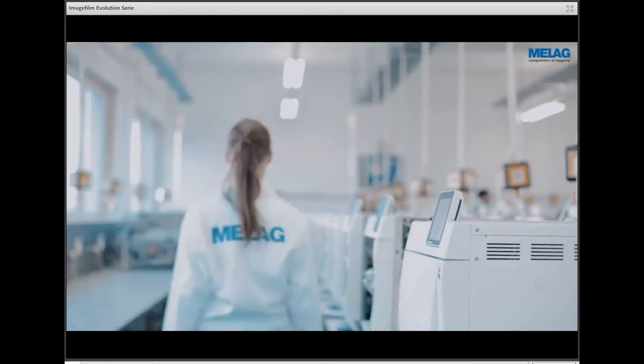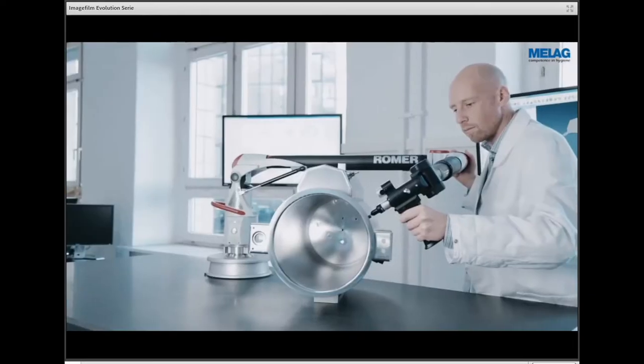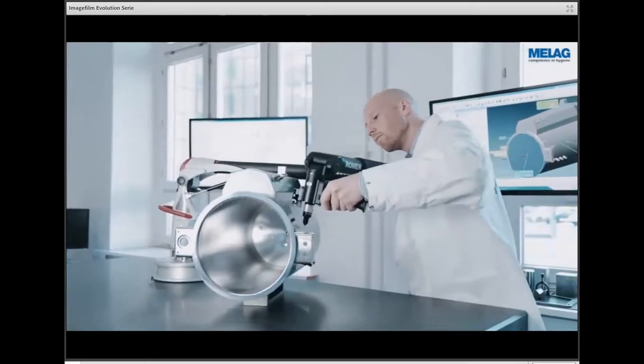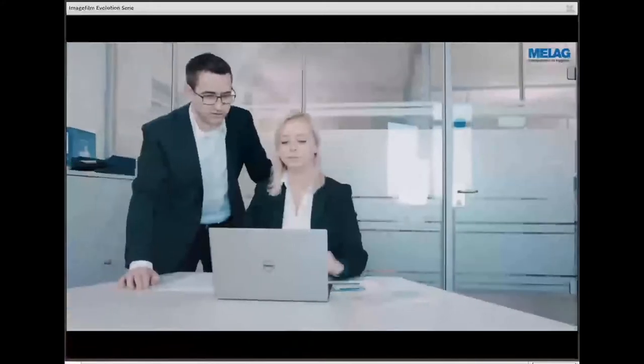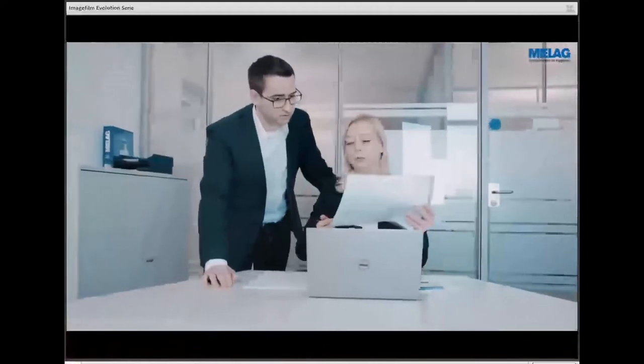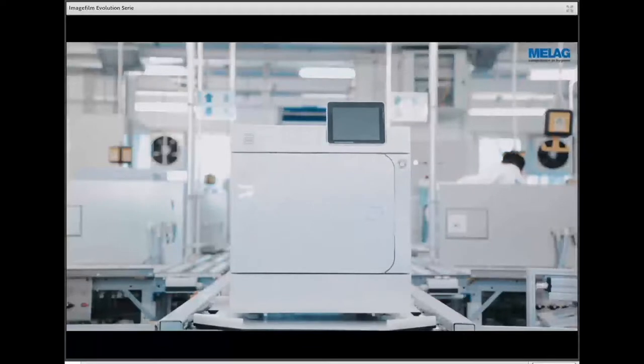Before entering series production, our steam sterilizer prototypes are subject to thousands of endurance runs analyzed with special measuring equipment. This includes stress tests with comprehensive monitoring of device components and in-house laboratory testing. Top performance requires attention to detail. The concept is rounded off with an intuitive user interface and modern design. Many of our 160 engineers worked on the genesis of the new Evolution, and our solution is now being used in its natural environment — medical practice.